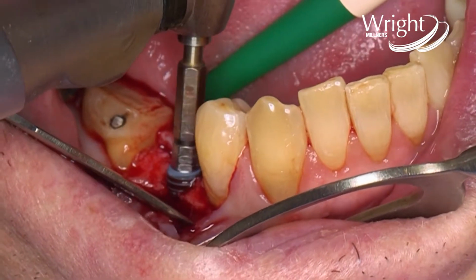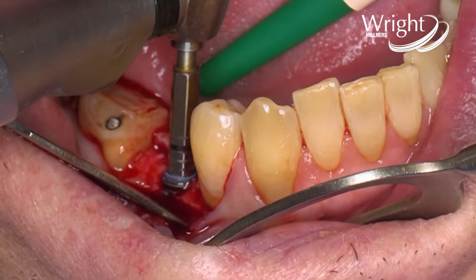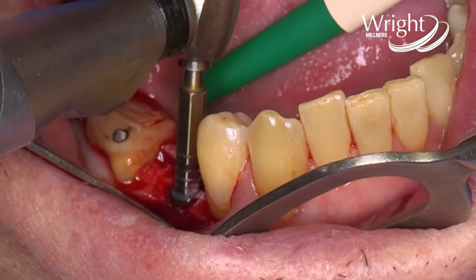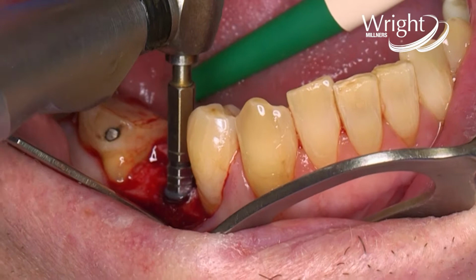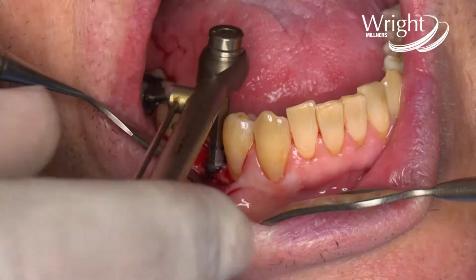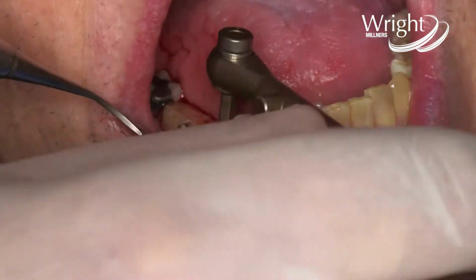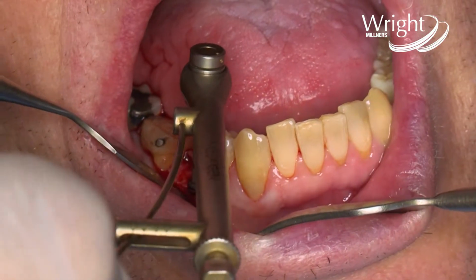But it may stop too soon, in which case we will then reverse it out and prepare a little bit more. So that's torqued out. We take the torque wrench with the hand wrench, and we're going to torque it down with this, just assessing how tight it is. But we mustn't feel too much pressure. It's already at 45 and it's not sinking. I want it to be 2 millimeters below.